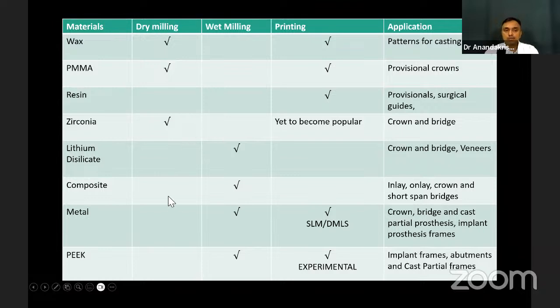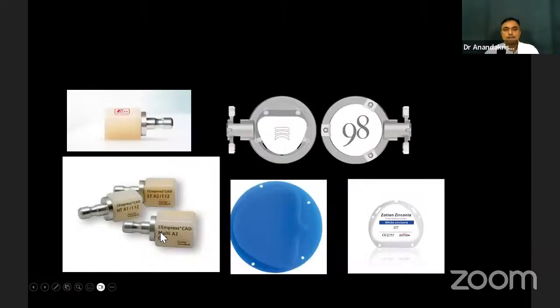When you think of materials, you also have to think of a multitude of biomechanical factors: what can fit into that particular situation, what are the forces that are acting, what are the bending forces that are acting. When you think of all these things, sometimes PEEK emerges as one of the best materials to do complex reconstructions. This is how the materials are supplied.